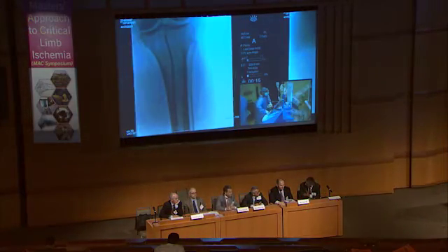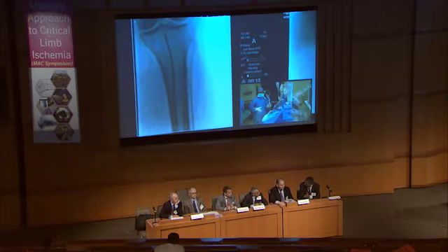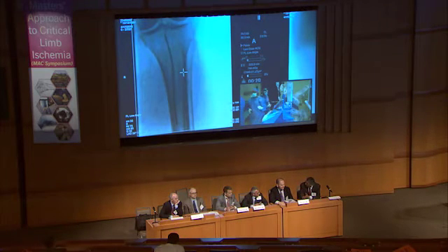So do you believe, I'm asking Alec because you're the surgeon in our midst, that this is just a superficial communication to the greater saphenous vein, or could it be deeper? How do you describe it, and what needs to be done after this CTO is opened?